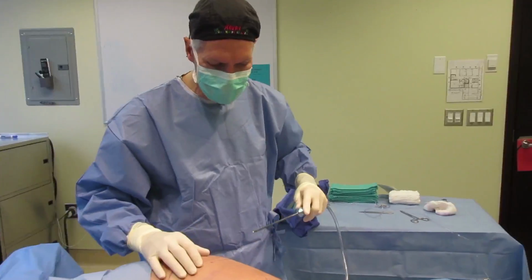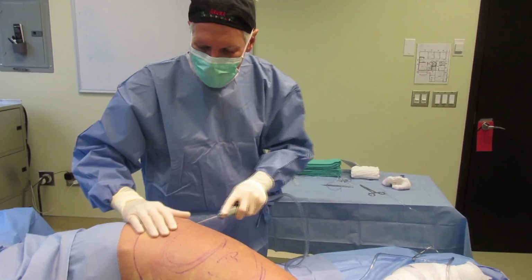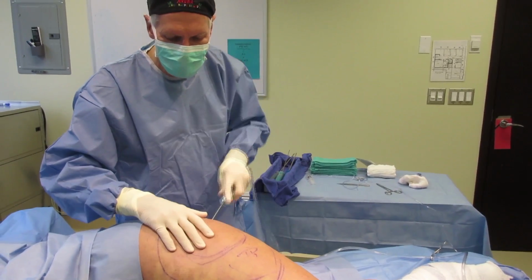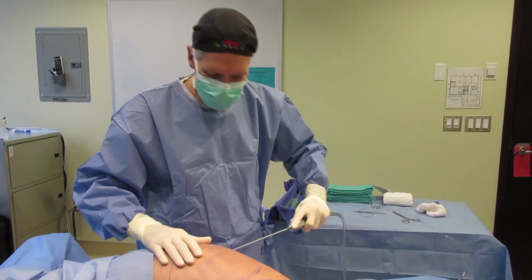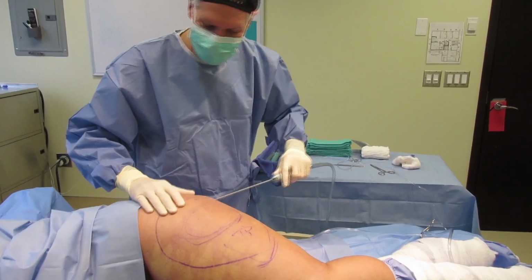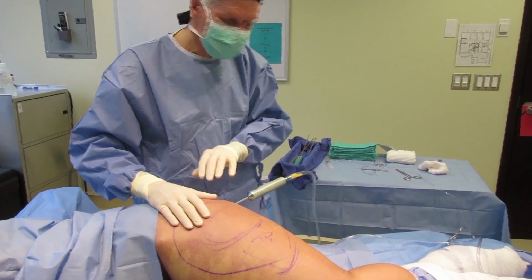So I'm about to do that now. I'll just have it off. Place it in the hole. Do a little pre-tunneling, as we call it, just so I know what the depth of that cannula is. Okay? And then when I turn on the suctioning, we'll start to see fat coming out of this tube, which you'll see in a moment. It should be nice and yellow.